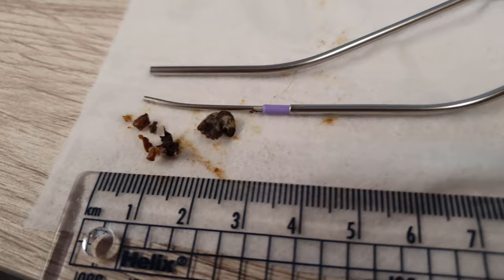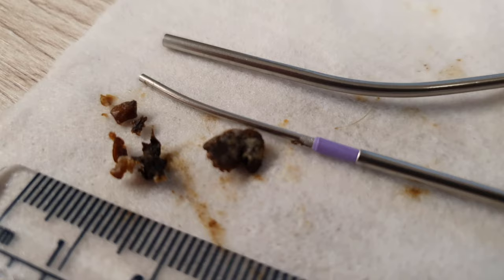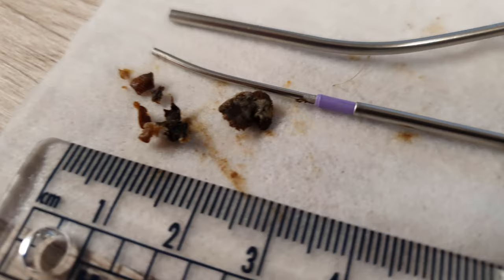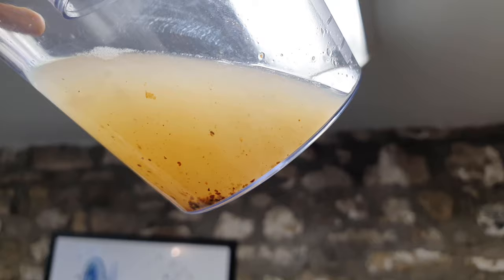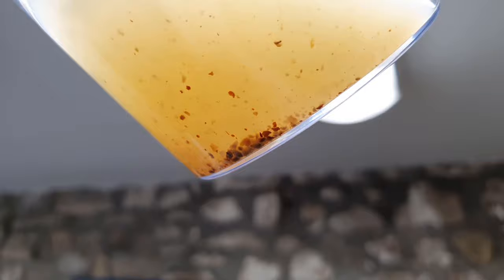One final look at the eardrum and we can see the aftermath of what we removed — about a centimetre, centimetre and a half, just from pulling that out of the recess. That's quite a large amount considering such a small space can conceal so much wax. The fine end there is the one with the purple sleeve, and here is the tank — no huge chunks but lots of small flakes removed.